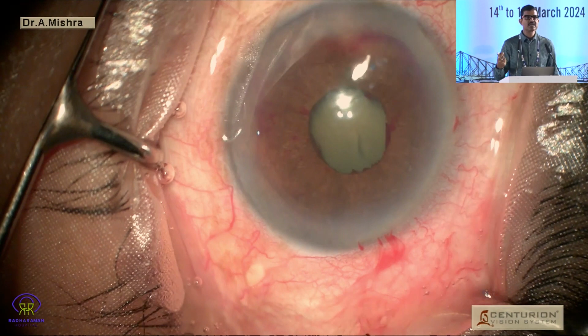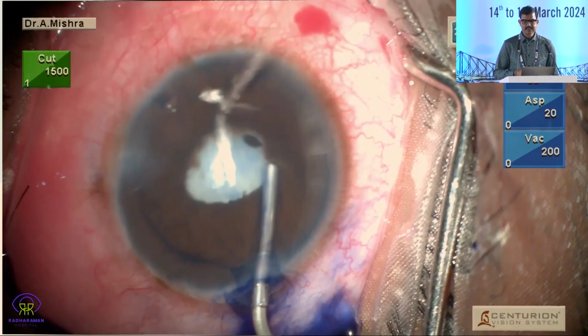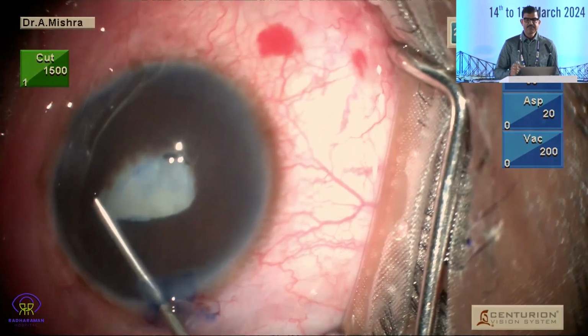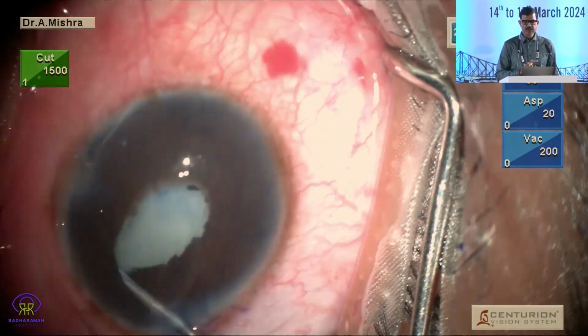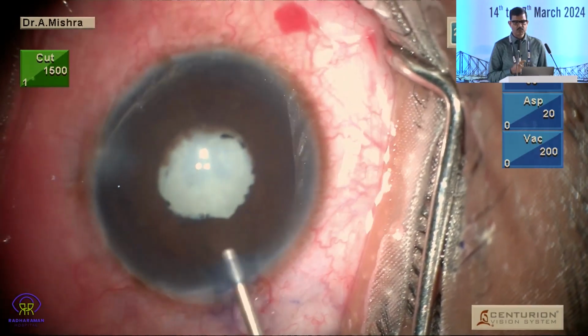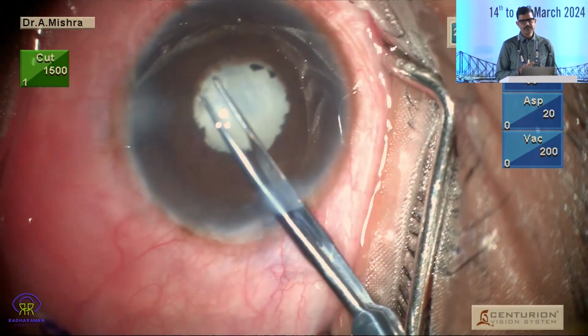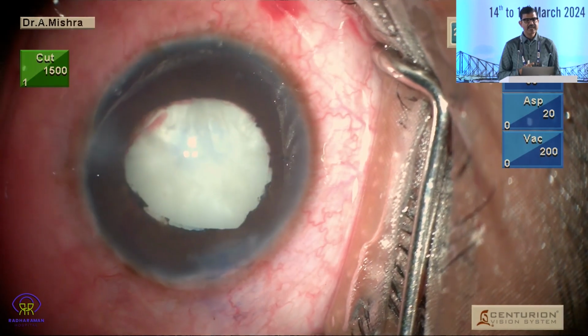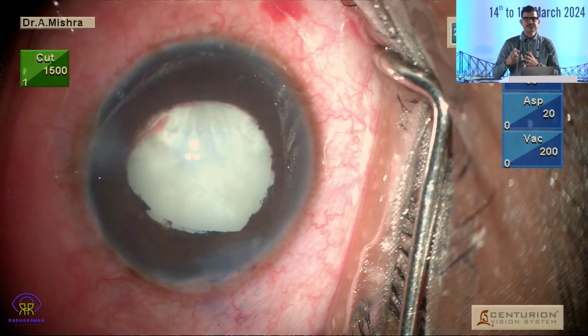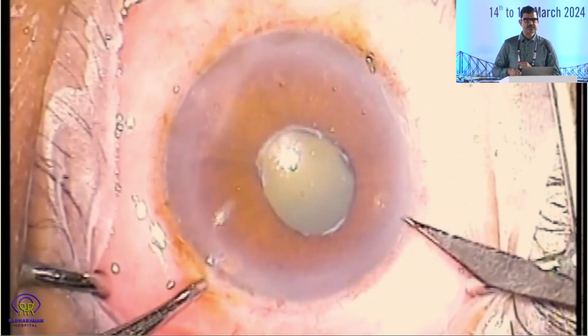At times, removing these membranes just restores its geometry. It becomes more circular so that you can implant the devices. At some other points, however, peeling the pupillary membrane actually causes very effective dilatation. You might not need any device after that. So this is one such case wherein the pupillary membrane was removed, peeled off from the margin, and look at the way it dilates after that. So the mechanical restraint, the moment it's removed, it dilates very well in certain cases. So we should always try to do that.